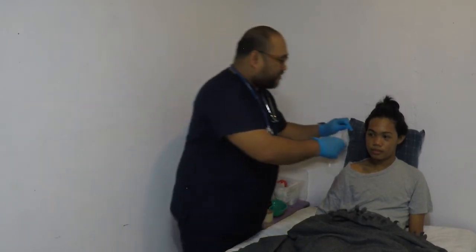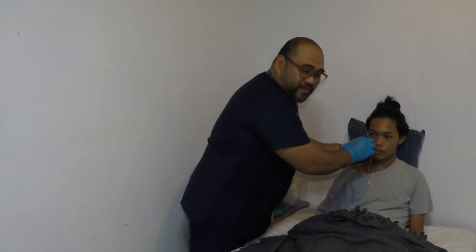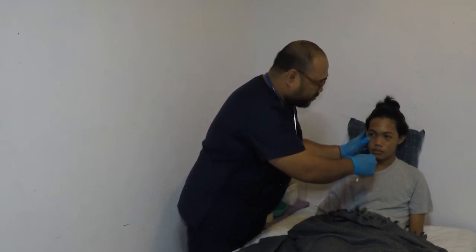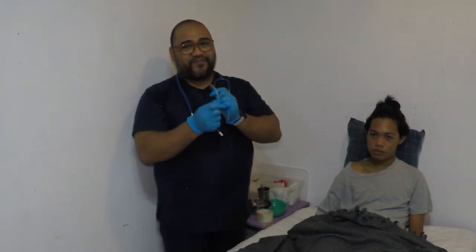So if the tube is attached inside the nose, you have to slowly remove the tape. Then slowly pull the tube. Then if the client coughs, okay, then rapidly remove the tube. Continuous slow pulling it out can lead to coughing or discomfort. That's why when the patient or the client coughs, you have to rapidly remove the tube right away.